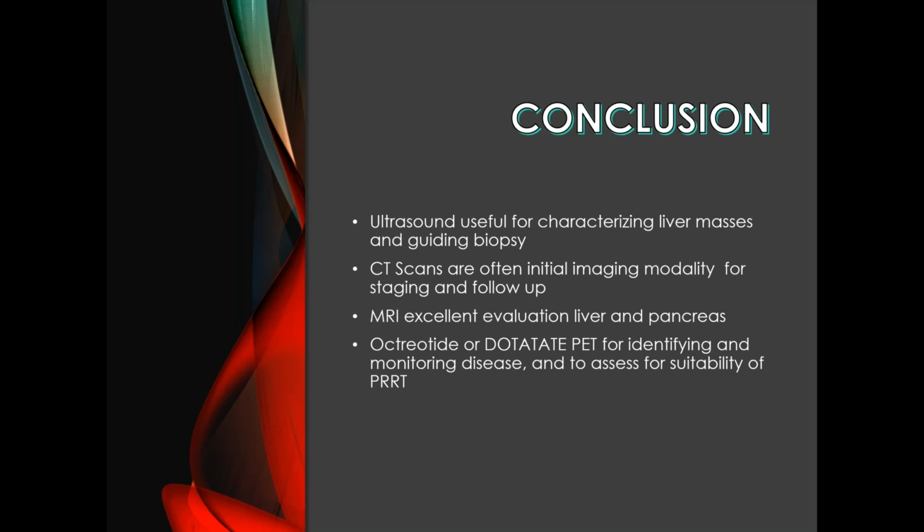Okay. So hopefully that response also addresses the question from an individual, which is what is the best scanning method for bone metastases if a gallium-68 is not available? Yeah. In general, for neuroendocrine tumor bone metastasis, I would suggest actually an Octreotide study would be better than a bone scan.